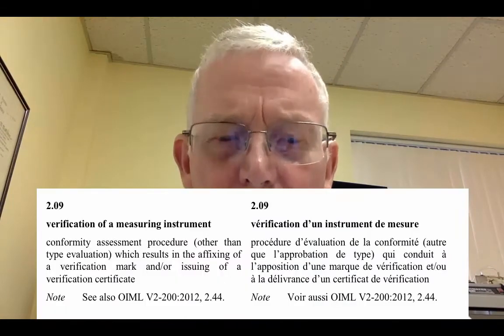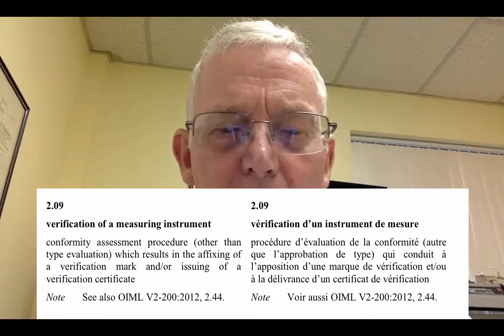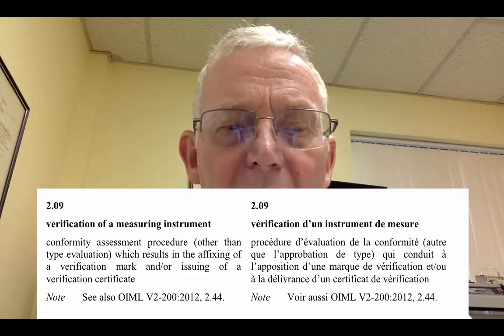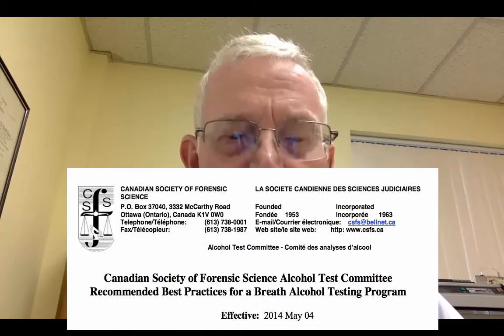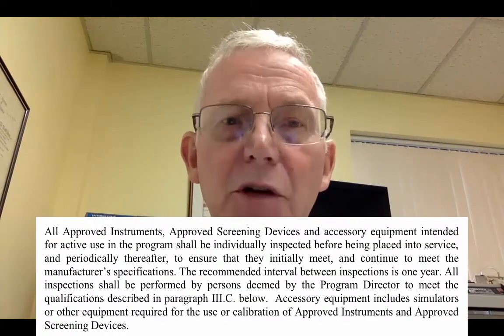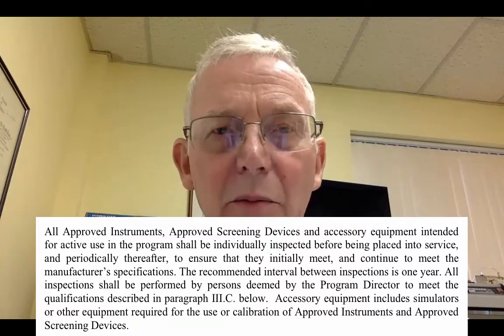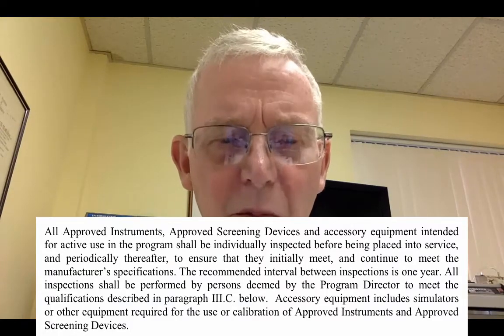But how do we make sure that those new instruments, before they're put into service by the police service, are in accord with the manufacturer's specifications? Is there some recommendation by the Alcohol Test Committee with respect to that? And the answer you're going to get from a Crown expert is that yes, they should be inspected when they are received, and then they should be periodically inspected thereafter. You'll find that in the best practices document by the Alcohol Test Committee. That's the answer you're going to get from a government expert.